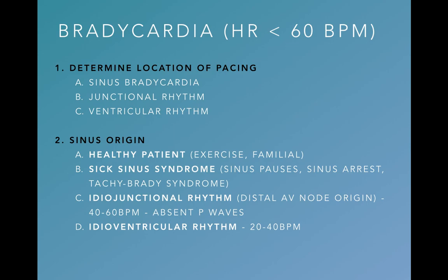Sick sinus syndrome, which is an umbrella term for things like sinus pause, sinus arrest, tachybrady syndrome. It could be an idiojunctional rhythm, also known as just a junctional rhythm, kind of what I talked about before, and idioventricular. So I'm repeating myself.